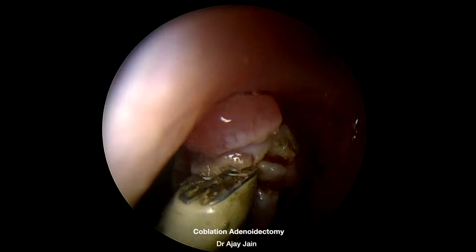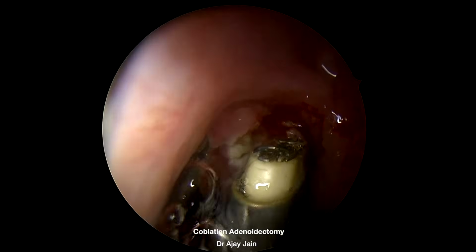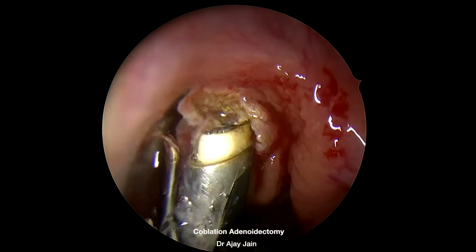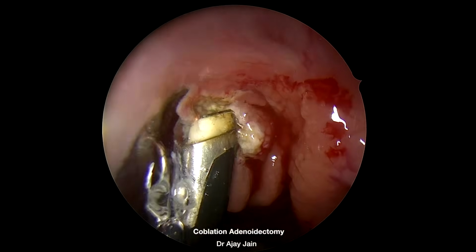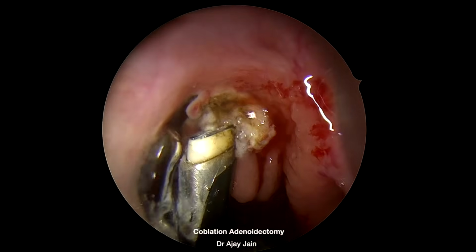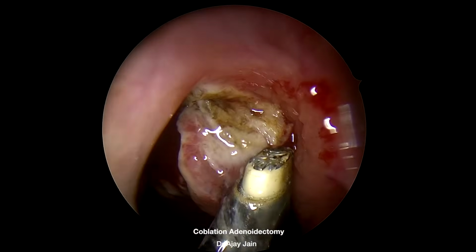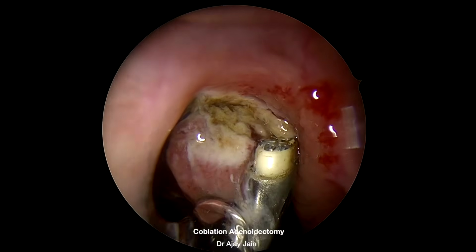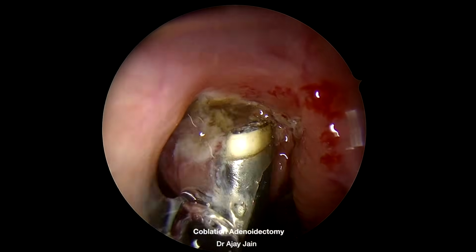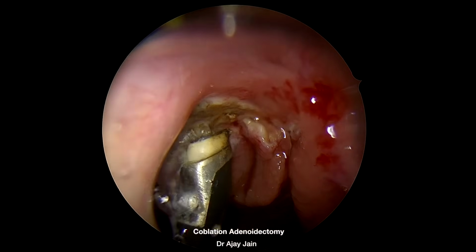At this stage, the adenoid is elevated gently and separated directly from the superior nasopharyngeal fascia and periosteum rather than being removed piece by piece. This produces a smoother and more anatomical dissection. Now I have identified superiorly. I am gently pushing the adenoid tissue backward and inferiorly towards the nasopharyngeal area, and now I am separating this from the periosteum. As you can see, I have identified a plane and periosteum is clearly visible.